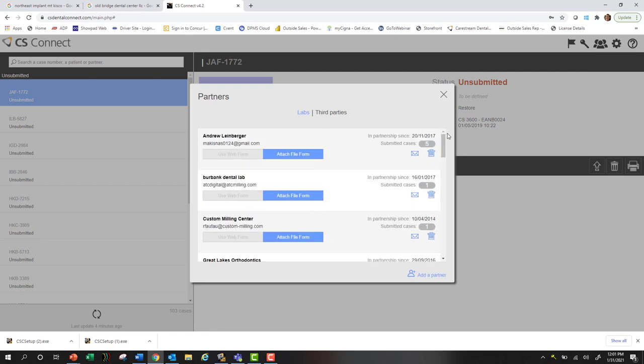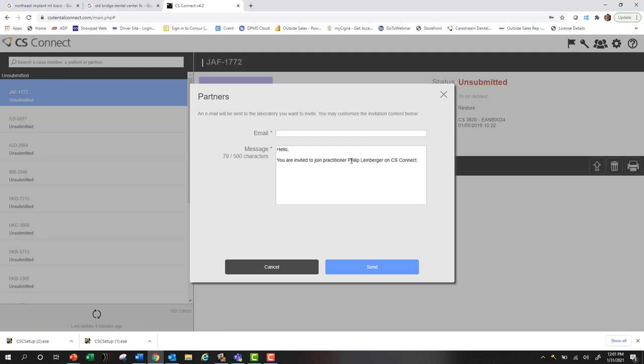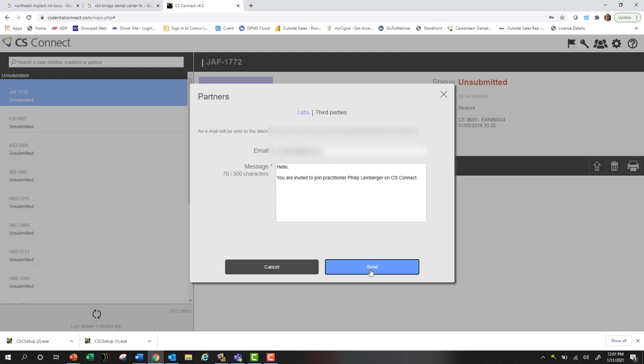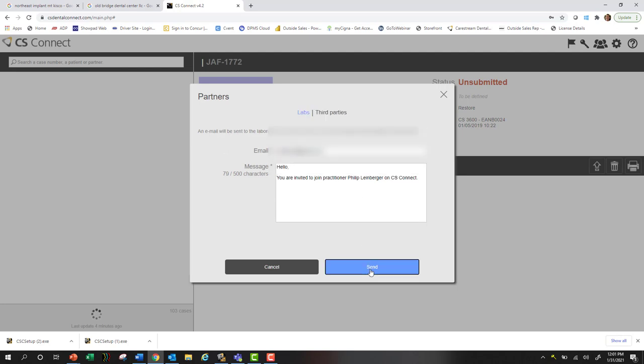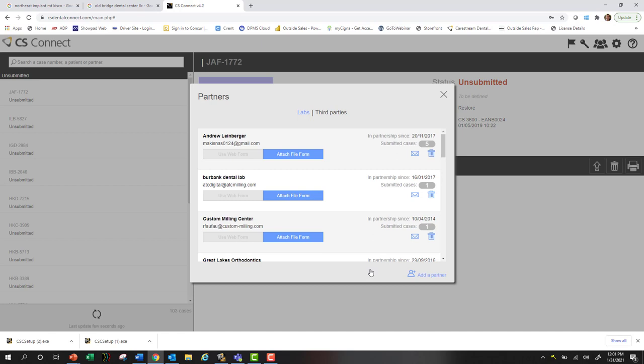To add a new partner, I'm going to select this icon down here, add new partner, and all I need is their email address. Type in their email and hit send, and they're going to receive an email with an invitation for CS Connect.